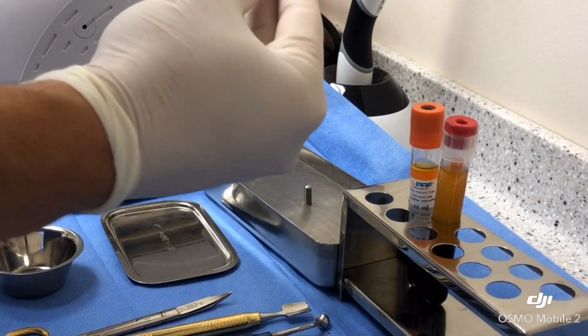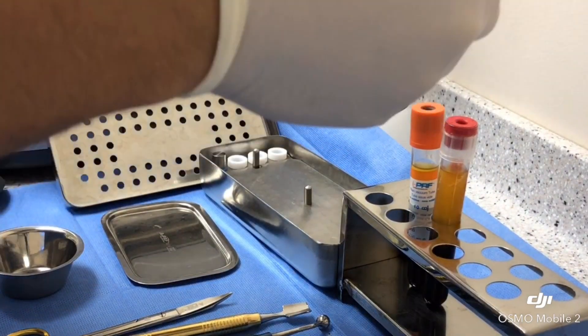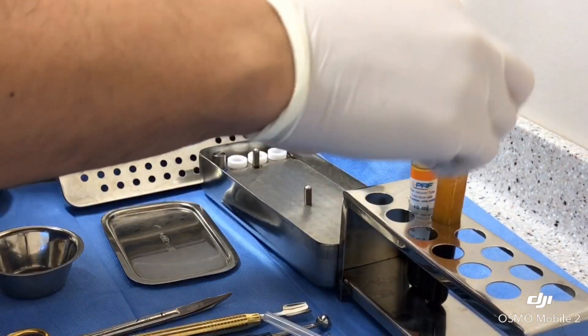Here we are harvesting the PRP, or the liquid portion of the spun blood, to irrigate the socket.